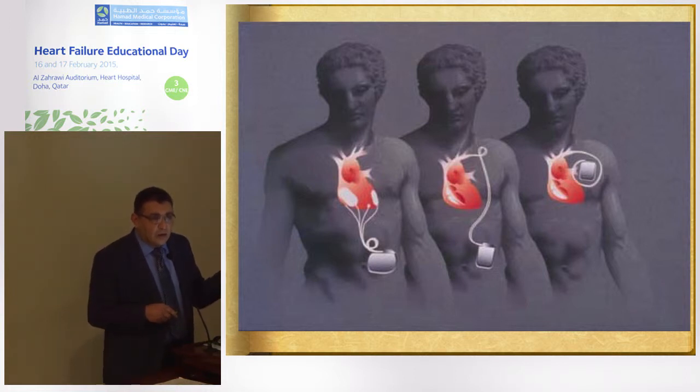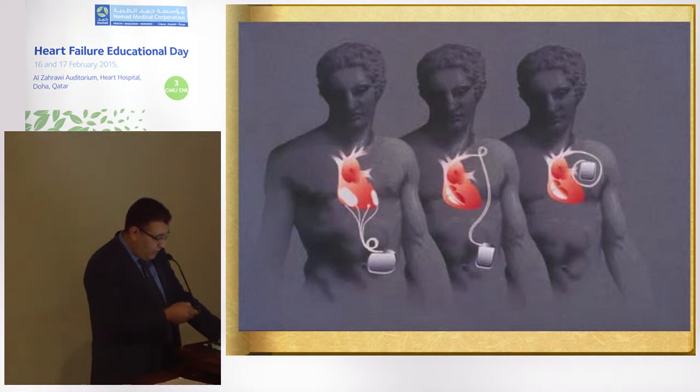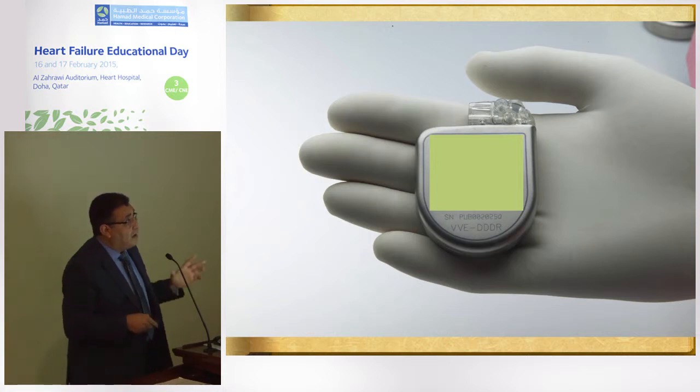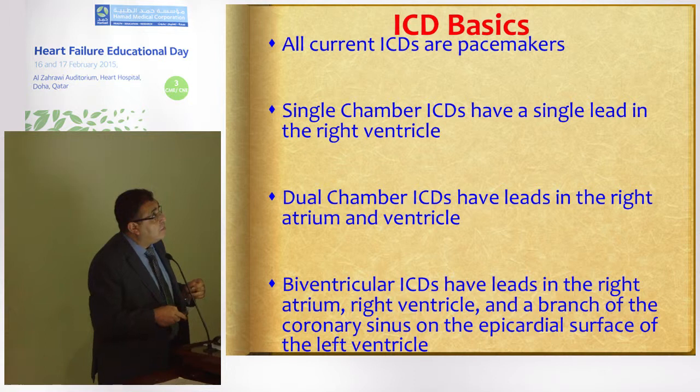They are not only helpful with the termination of dangerous ventricular tachyarrhythmias, but they also have features for heart failure management as well, which I will allude to during my presentation. This is the size of the devices, where it is really becoming quite small.